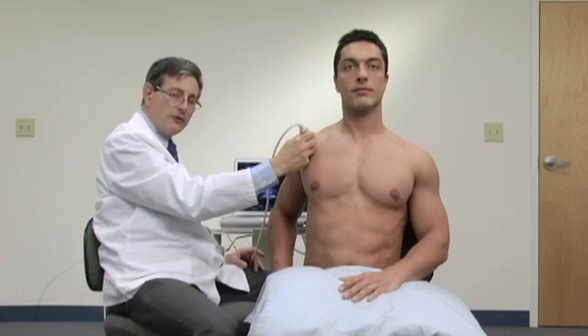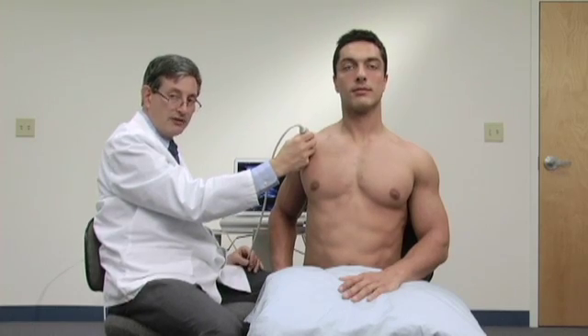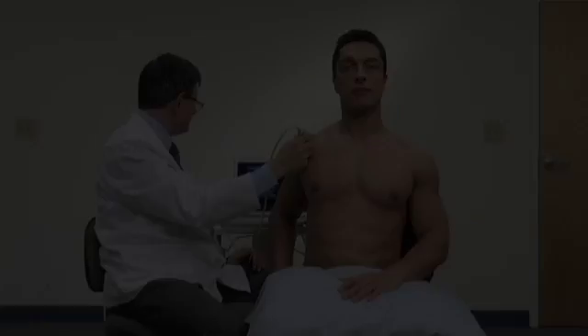That tells me I'm right at the anterior edge of the supraspinatus — a very important region, because that's where we see most of our rotator cuff tears.